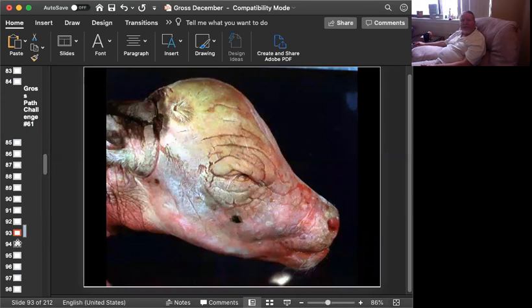Slide number 9 is tissue from a stillborn fetus. Can you give me a morphologic diagnosis and a cause? Okay, stillborn fetus are probably an abortus, even better, because we don't have a lot of hair. But what we do have are these plaques on the head or on the muzzle, and usually they accumulate on the dorsal surface of the animal, but often on the face. When I say dorsal surface, it's the neck and the back.